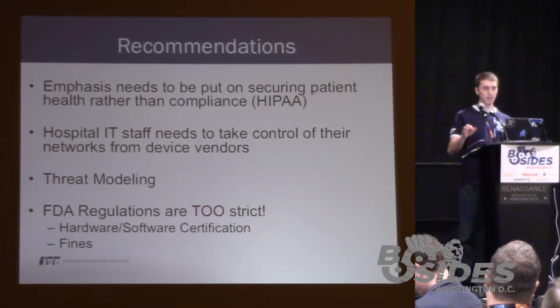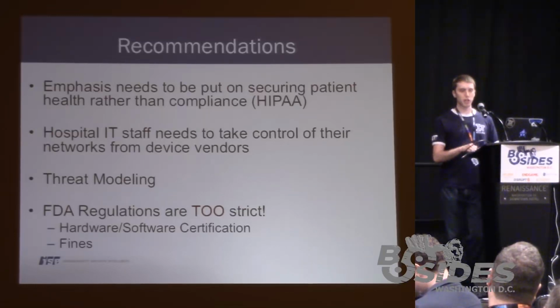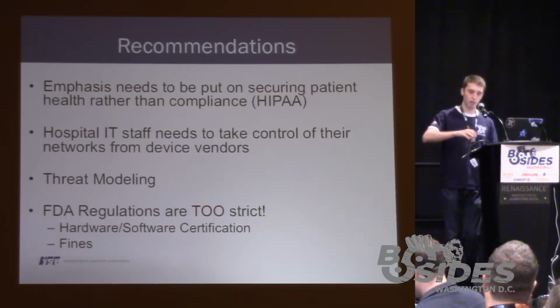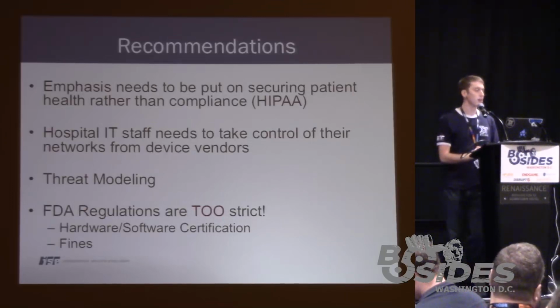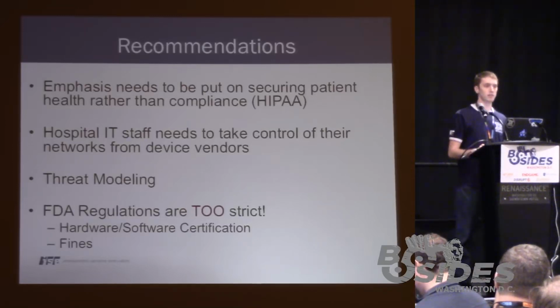So the specifics of the certification process I'm not intimately familiar with, but I do know that there is a clause that certain changes are permitted without the device having to go through a recertification. But if you were to address one of those web vulnerabilities that I discussed earlier in the software, and it produced a new firmware file, I'm pretty sure you're going to have to go through that certification process again. That same certification process and the length of it, along with the cost, is why you're still finding Windows 98 on medical devices today. Case in point.